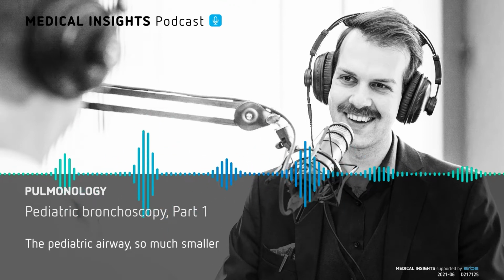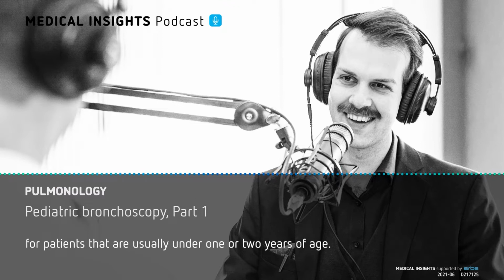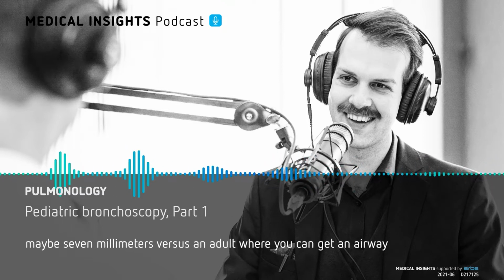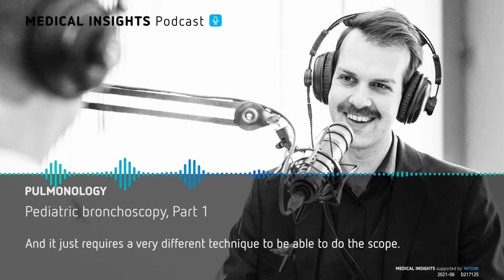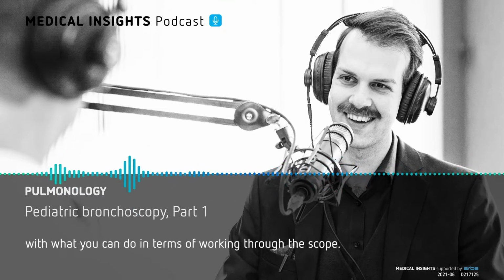The pediatric airway is so much smaller. With most of our kids, we're doing bronchoscopy for patients that are usually under 1 or 2 years of age. So your airway at most is going to be 5, 6, maybe 7 millimeters versus an adult where you can get an airway that's going to be a centimeter or 2. And it just requires a very different technique to be able to do the scope. There is a lot more limitation with what you can do in terms of working through the scope.